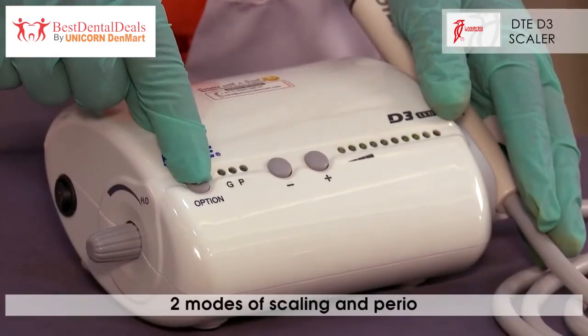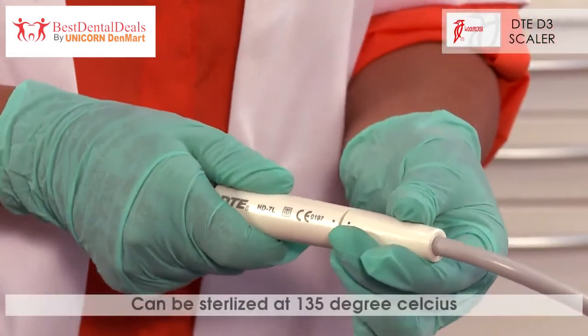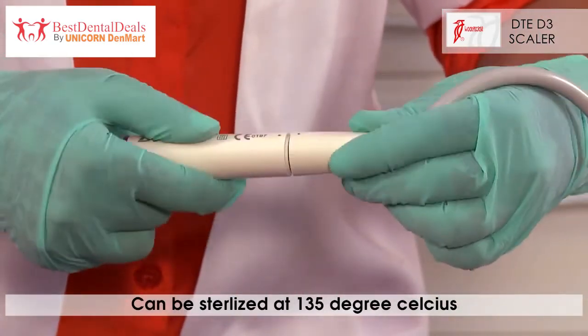It works on two different modes of scaling and perio. The scaler has a detachable handpiece that can be sterilized at 135 degrees Celsius, making it safe and easy to use.